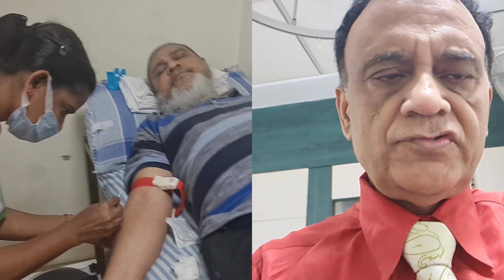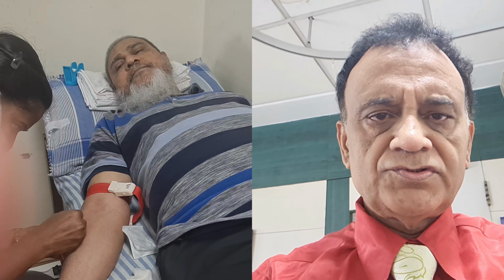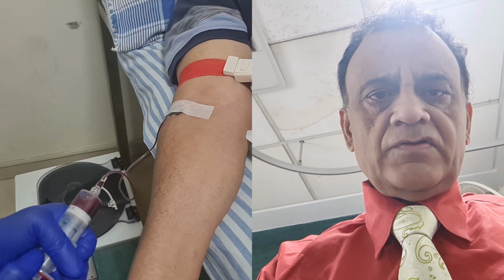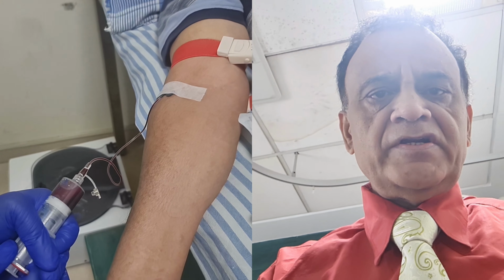How is it feeling now? Better. Better? Yes. How is the pain? No pain. We are going to do a PRP procedure on this gentleman. This is drawing blood. We draw only 15 ml of blood.